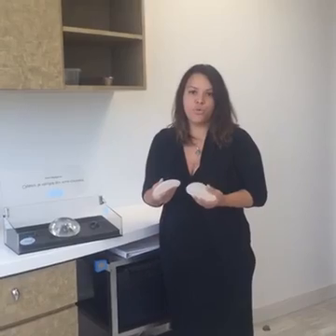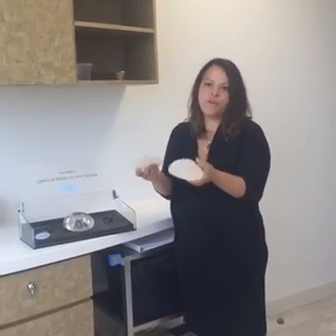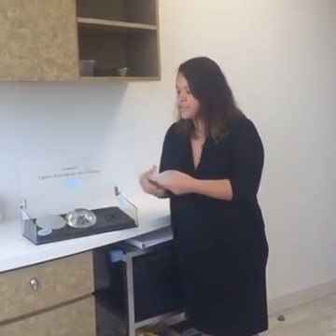Picking a shaped versus a round implant is a little bit dependent on what your overall goal is. One of the things that your surgeon should go through with you is, what are you trying to achieve with this breast augmentation? Do you want more cleavage, more upper pole fullness, or do you want to appear natural but just a little bit larger than what you are now? That's a very personal decision and part of the long discussion that you should have with your surgeon.